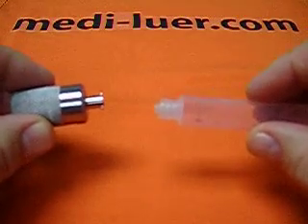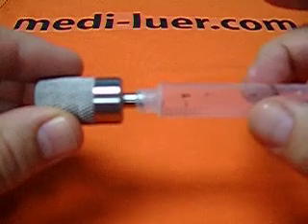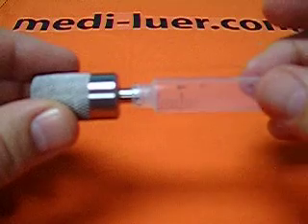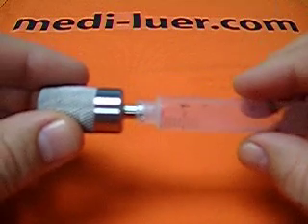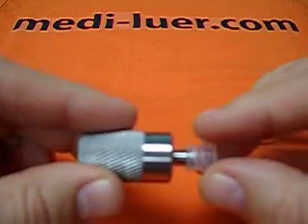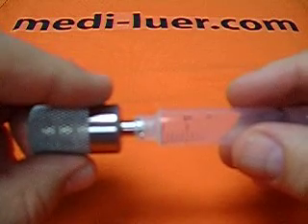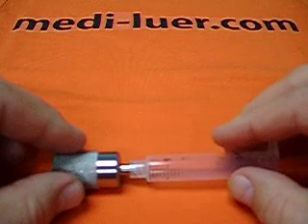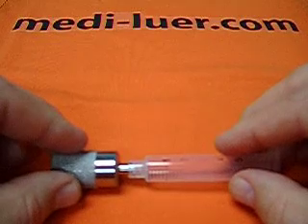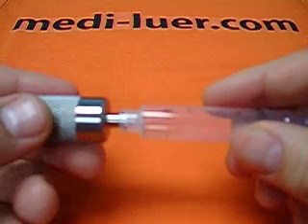To assemble the reference fitting, you put the two together using extremely light force — essentially no force — stopping as soon as it gives any resistance whatsoever. Once you get it to that point, you then apply a specific amount of force and a specific amount of torque at the same time to make the assembly. Because the force and the torque are given as maximums, you want to not exceed them, and because they are specific amounts, doing it by hand is not recommended.